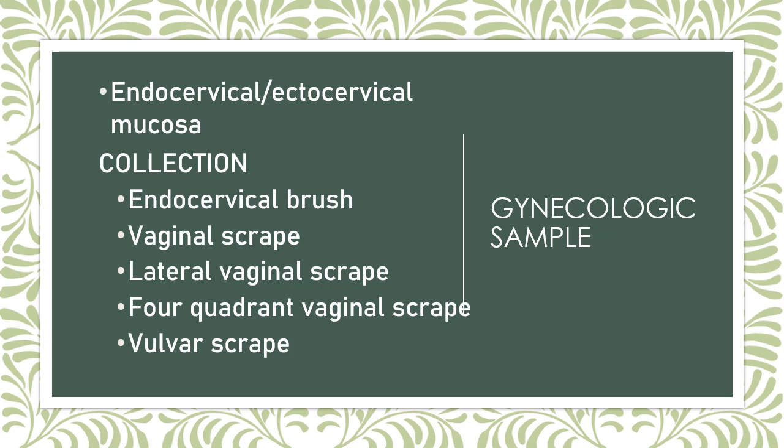So the site of the sample should be here. T zone sampling is important for the detection of your cervical malignancies.